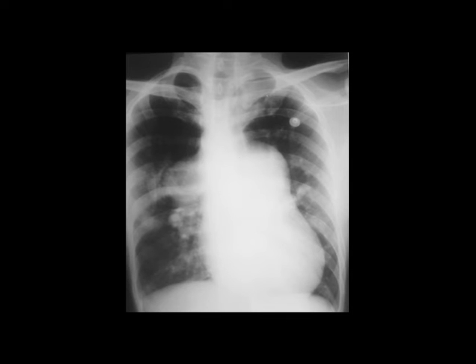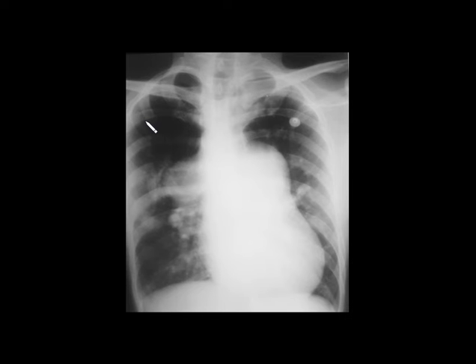Coming to the next case, you can see classical dilatation of the main pulmonary artery, right branch of the pulmonary artery, right ventricular hypertrophy, and pulmonary oligemia. This is a case of pulmonary arterial hypertension. Remember: dilated pulmonary artery, pulmonary oligemia with hypertrophy of the right ventricle, and upturned apex.